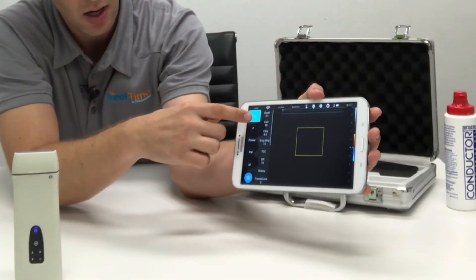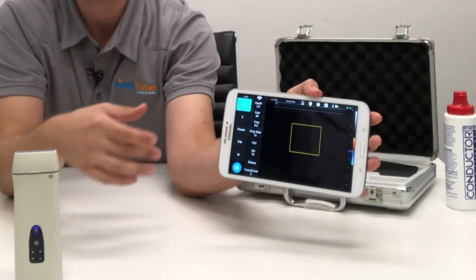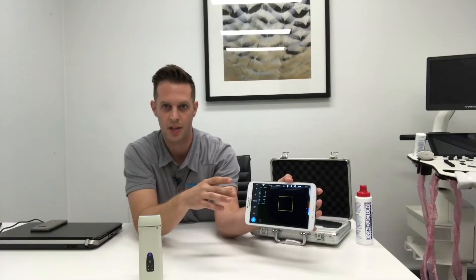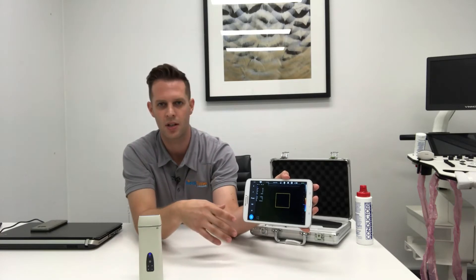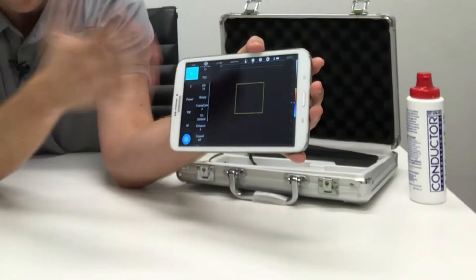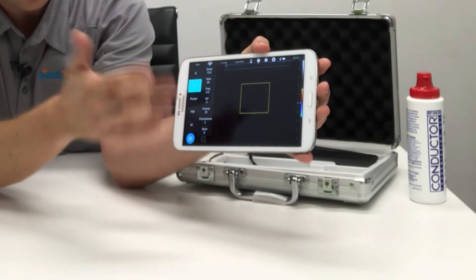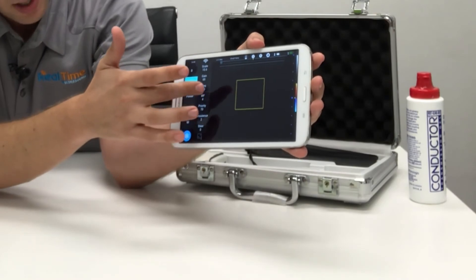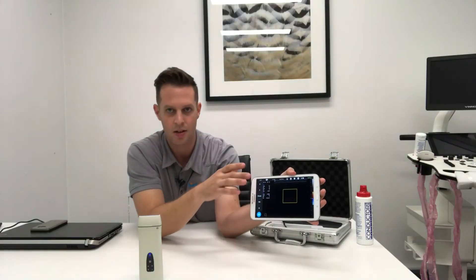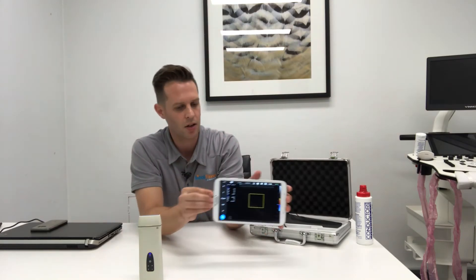Under the B menu you have all your image optimization parameters — things like depth, frequency, and gain — all the things you'd be used to seeing on an ultrasound machine. It has enhanced mode, harmonic imaging, TGC sliders, and dynamic range all under the B menu. Likewise, under the color menu you've got things like wall filter, persistence, and steer. It has all of the advanced features you'd expect on a much bigger ultrasound system.